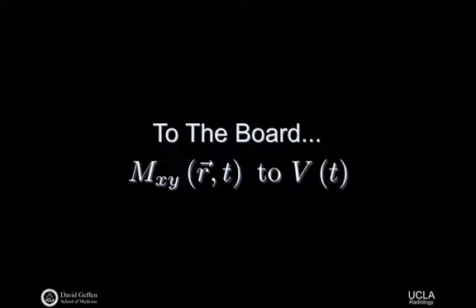The magnitude of these terms depends on things like gamma, which is big, B0 is maybe big. Big is a relative term that has to be relative to something else, but certainly big relative to any other description of what's happening to Mz. Here we took it as constant, maybe it's slightly time varying, but bottom line is very close to zero. And so this term here, the Z term on the bottom here, we take this as being very small.